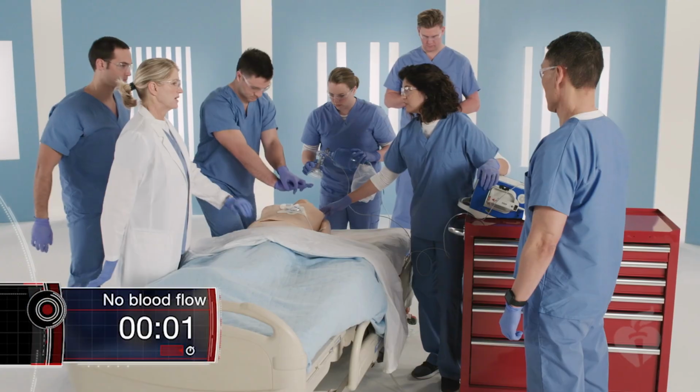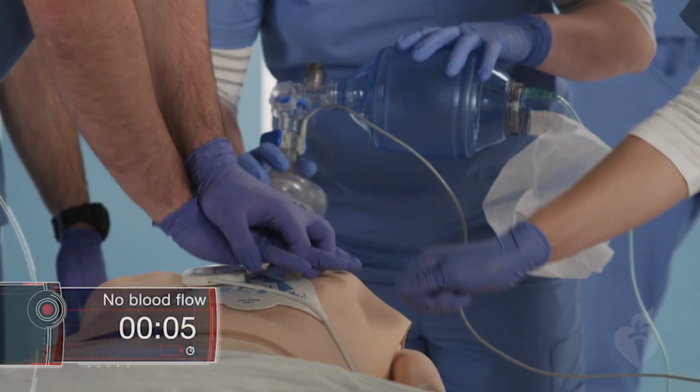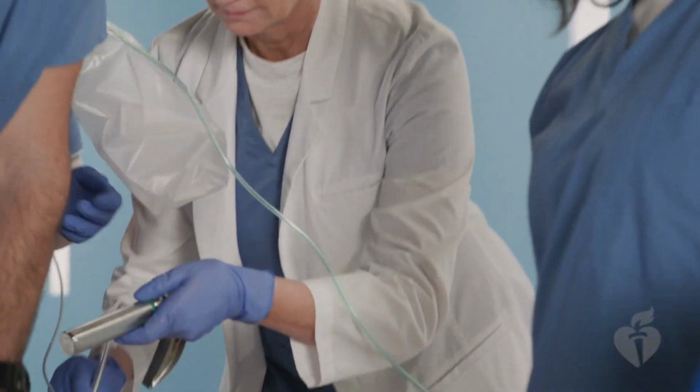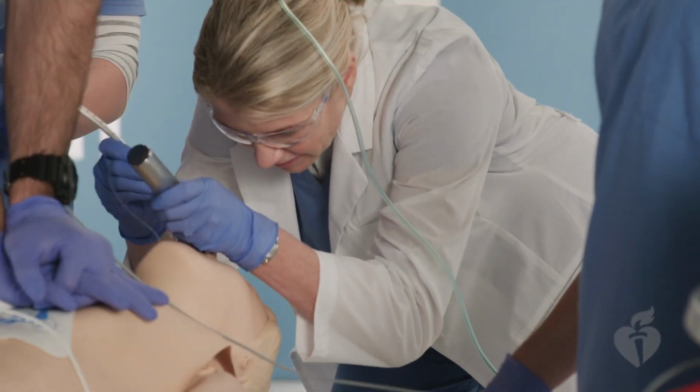"Switch. Okay, go ahead. Charge and shock. Clear. Shock. Resume." Except for intubation. Intubation should be performed by skilled providers, ideally without stopping compressions.